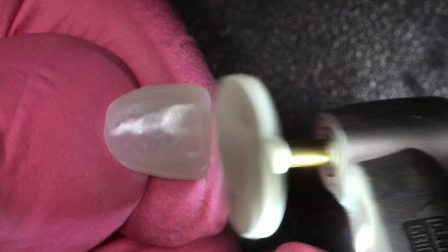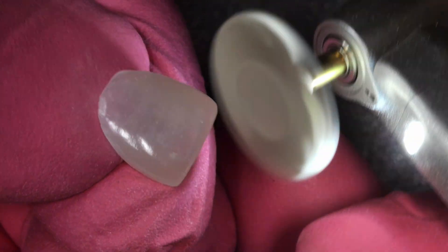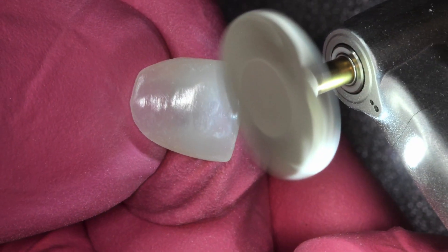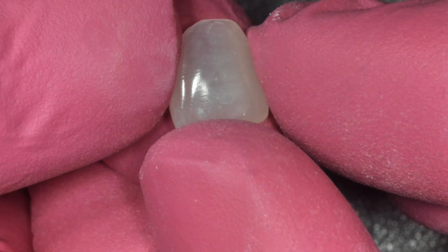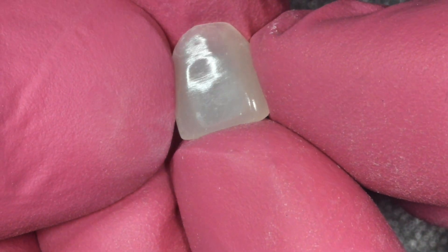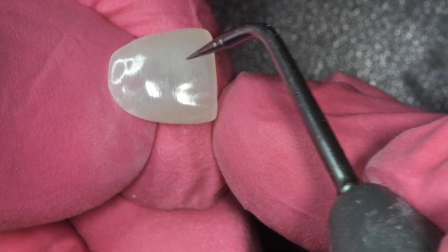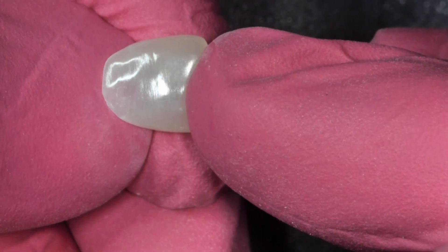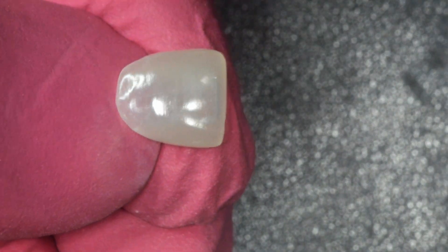Imagine a resin that you could print with ultra beautiful translucency, super highly filled, and hand polishes in a matter of seconds to an ultra high gloss — and the gloss is durable. This is a material that I've been testing and I think it's going to change how we think about 3D printing and restoratives. This was hit with a single rubber wheel — honestly an eBay polisher I got for direct resin — and the results are incredible. They're not easily scratched, you can't smudge it. It is a wet look to a print resin in a matter of seconds, and the translucency and optical properties of this material have beautiful lifelike aesthetics.